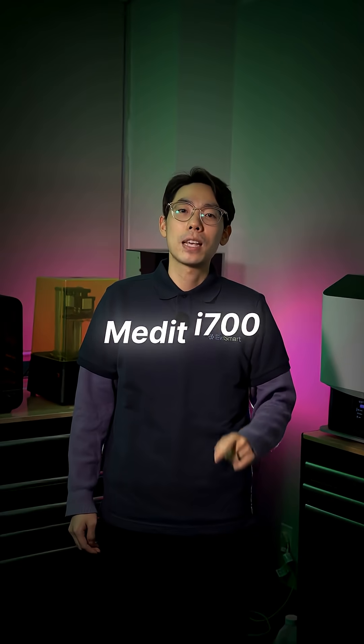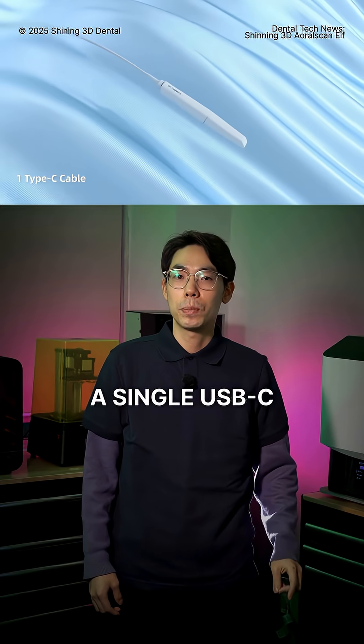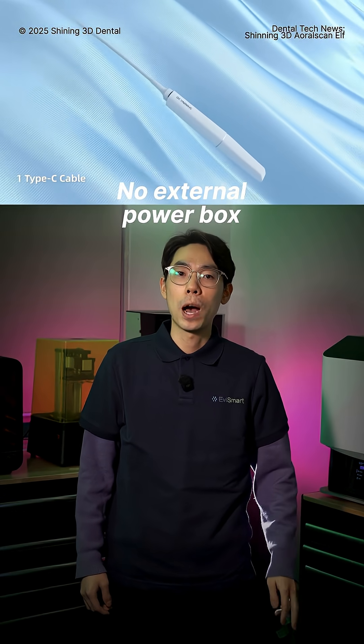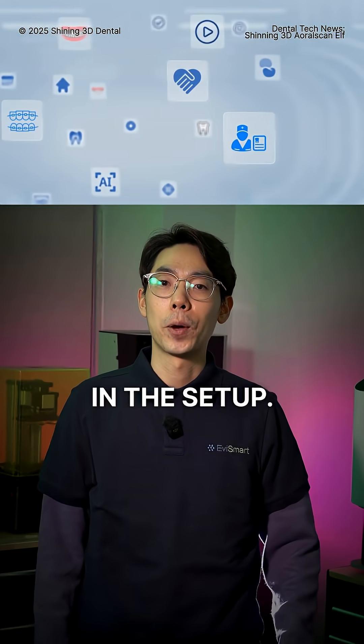For context, the Medit i700 is around 245 grams. The ELF connects through a single USB-C cable with no external power box — a shift from the AeroScan 3, which needed a separate hub in the setup.